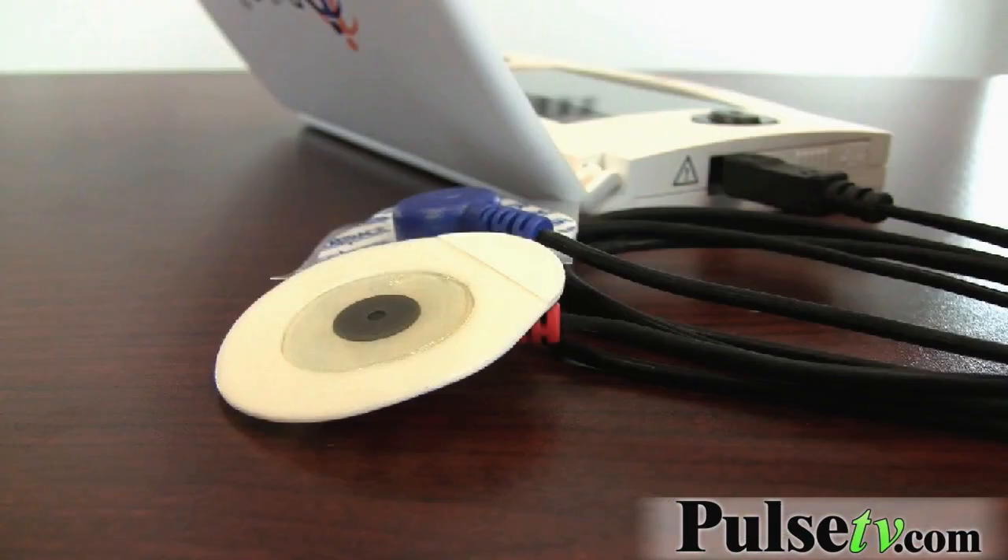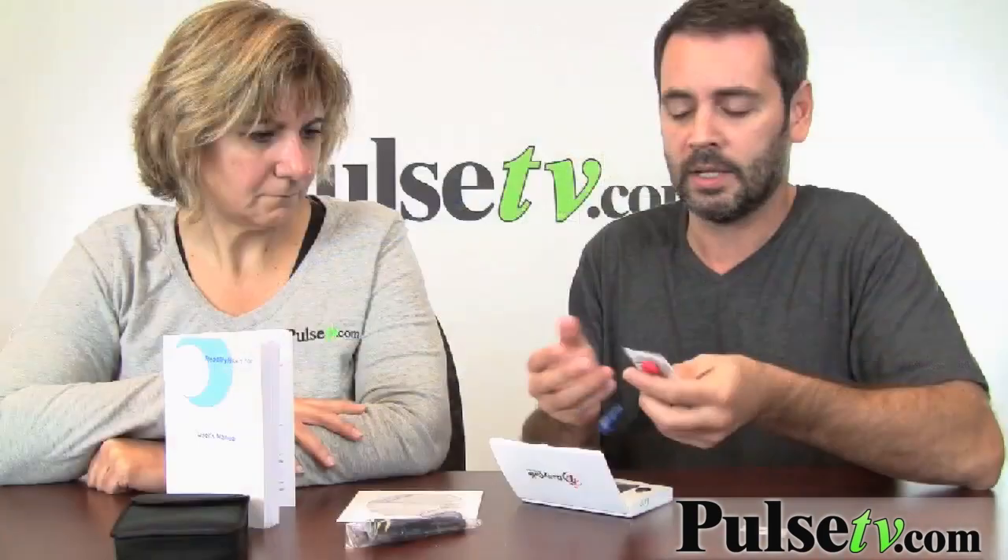If you consistently get the noise message, it might be a problem reading through the pads. You just attach this to the side, and these sticky pads go on your forearms and you get a perfectly accurate reading.